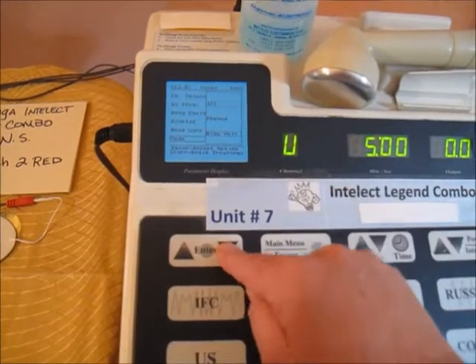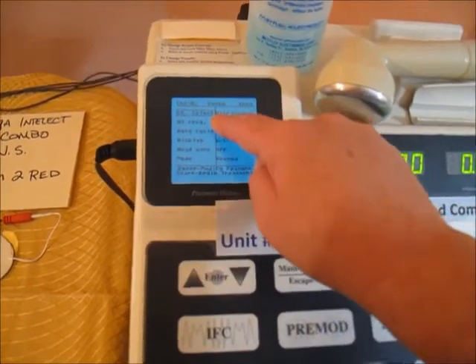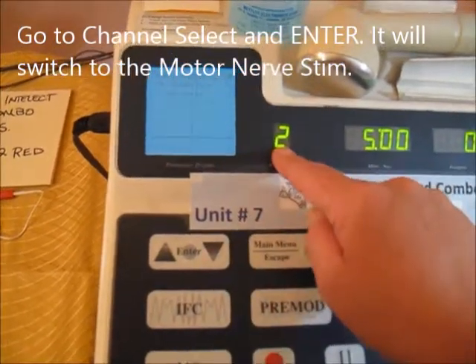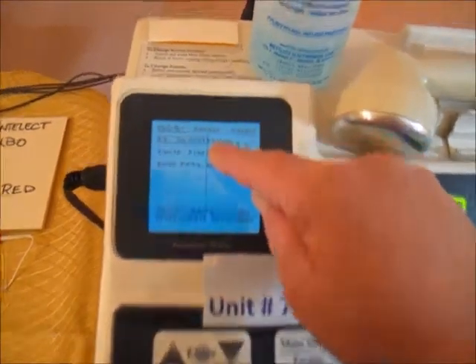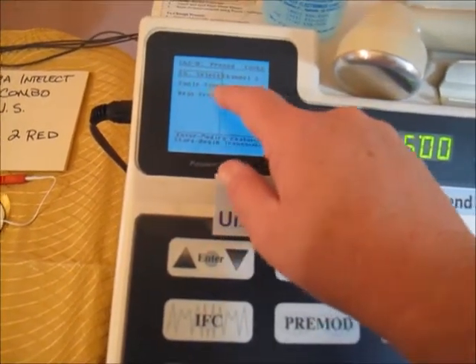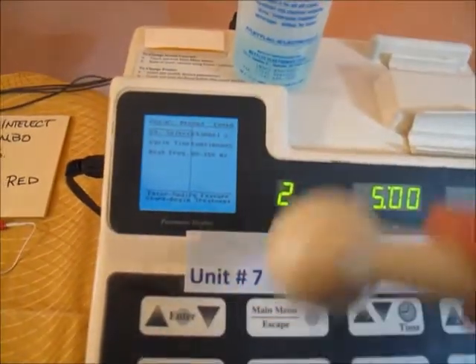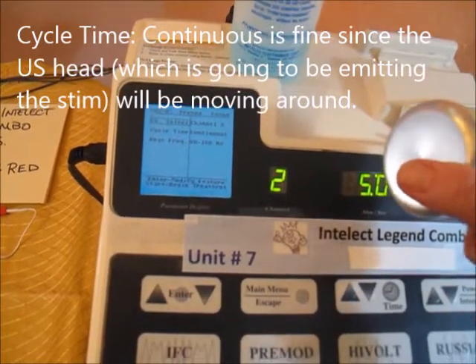We'll keep it on pre-mod. Go to channel select, hit enter, and it should switch to channel 2 — and now it's in the pre-mod setting, as you can see at the top. Since we'll be moving the ultrasound head during treatment, there will be ultrasound coming out of the head as well as motor nerve stim.